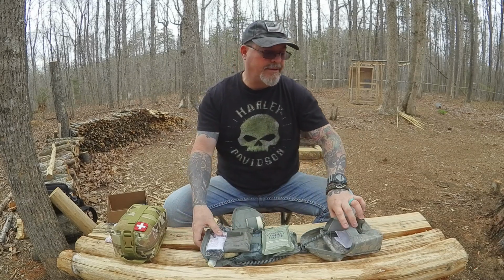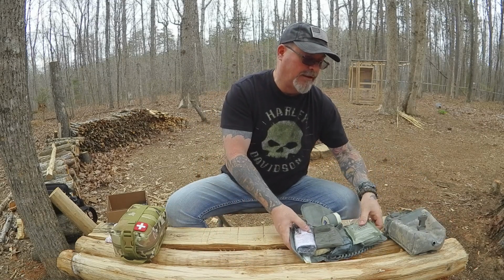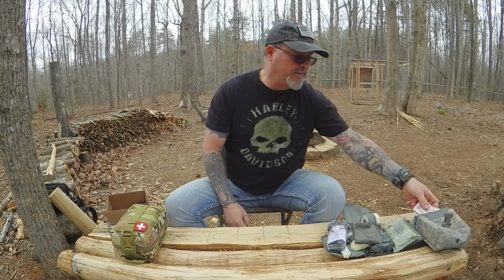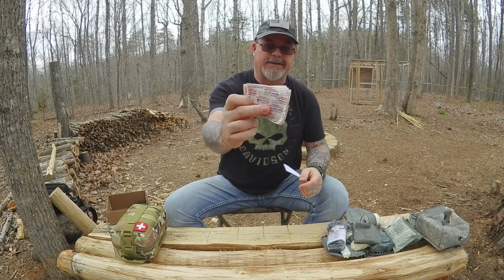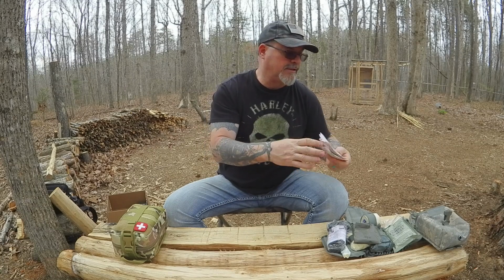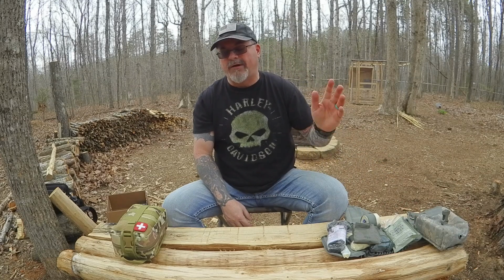Now, we're going to slide this over. And I want to keep it open because I want to do some comparing here in a minute. We're going to slide this over, and we're going to move to this. I'm going to put these bandages back over here. The add-on that I did is I added some regular Band-Aid bandages for smaller cuts and abrasions. That's about all I could fit in there.